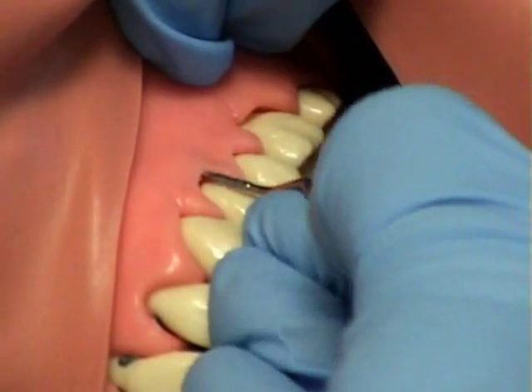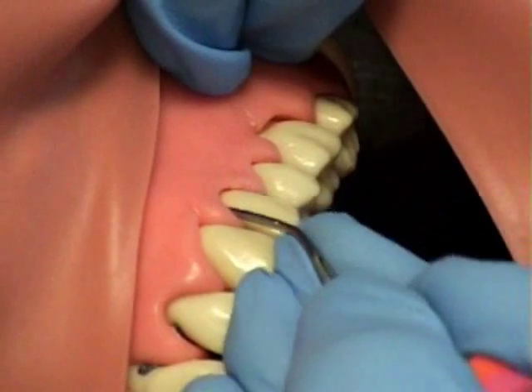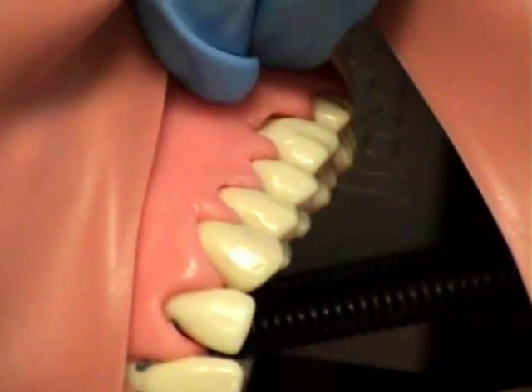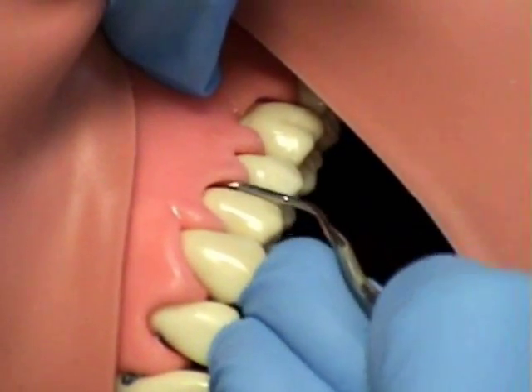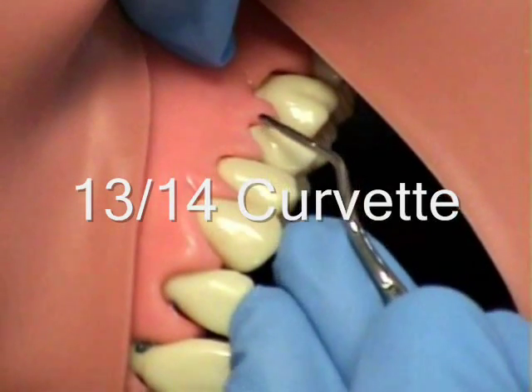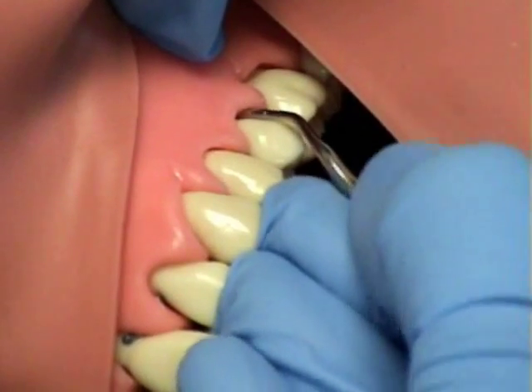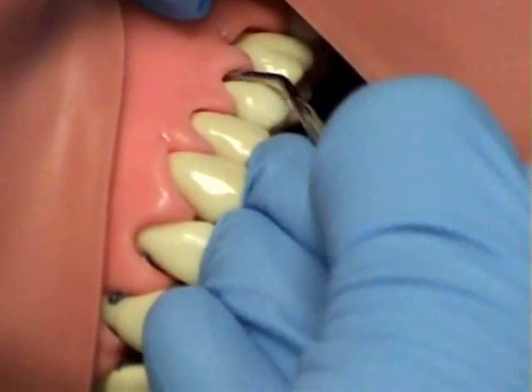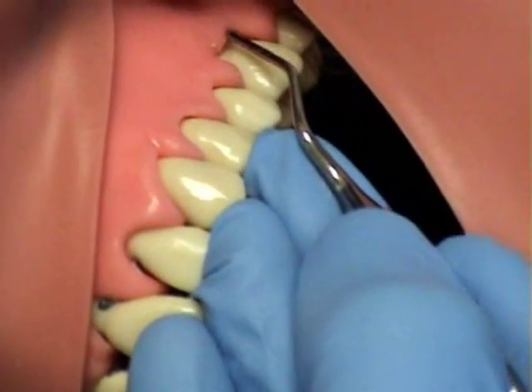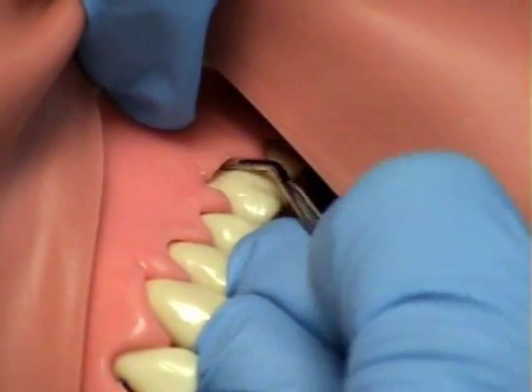This is a Vision Curette 1314, being used on the distal. It also has the 5mm markings for subgingival placement at 5mm, and the 10mm marking for debridement 10mm subgingival.